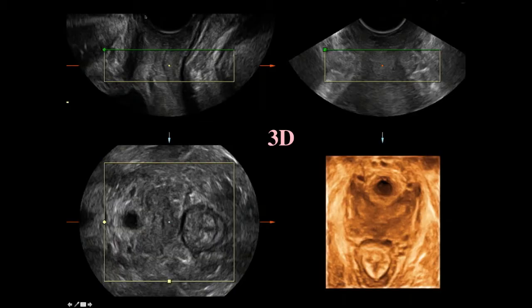So here we are about to do a 3D. This is my acquisition view right here, and I've got the vaginal probe. I use a vaginal probe to do it. It has high frequency, and it's easy to sanitize. You can look down the urethra, down the vagina, and down the rectum, and this is a rectal verge right here where it bends.